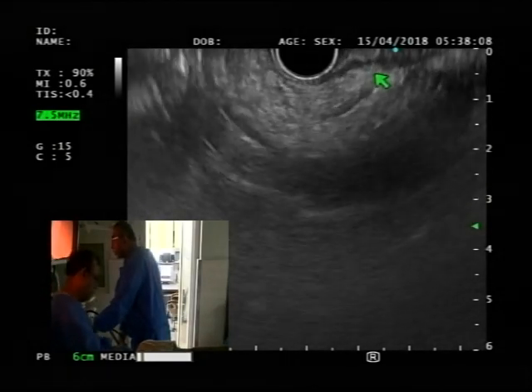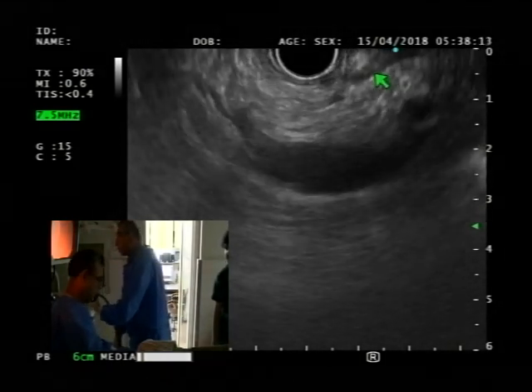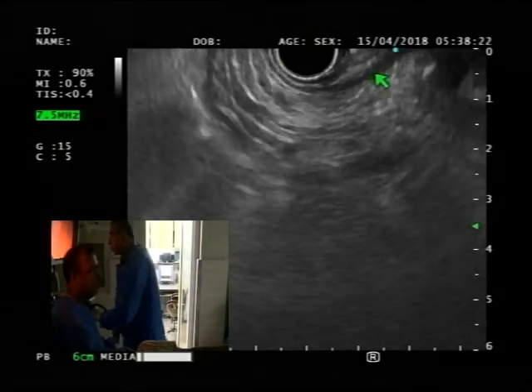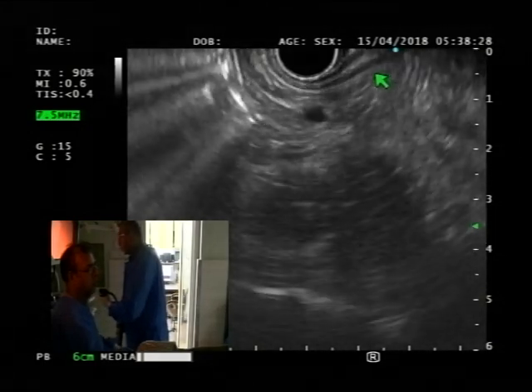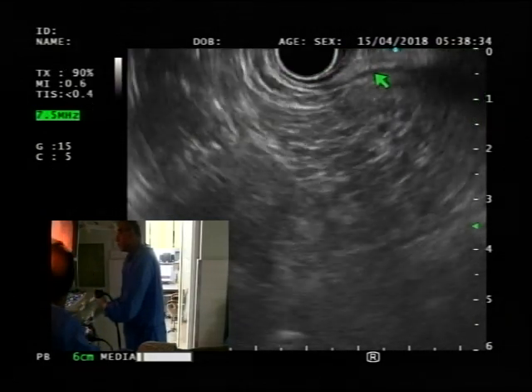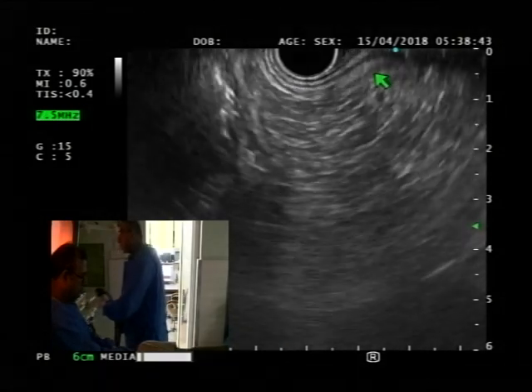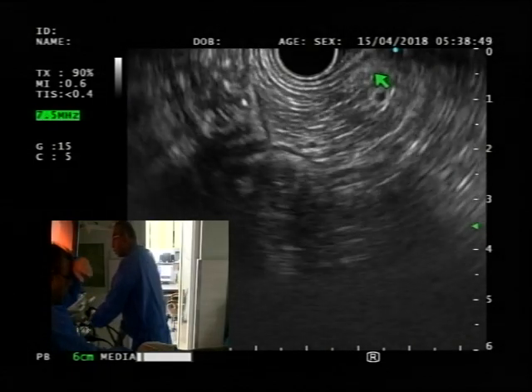Okay. I think you're taking one more pass? We did one. That should be good. Okay, yeah, I'll take a look. Suspicious, that's all I can say when I'm not sure. It looks like this side. I think, but irregular shapes, I think they're enlarged. They're large, they're spaced very. So some features there, and there's more than one bunch actually. So just focus on one for now.